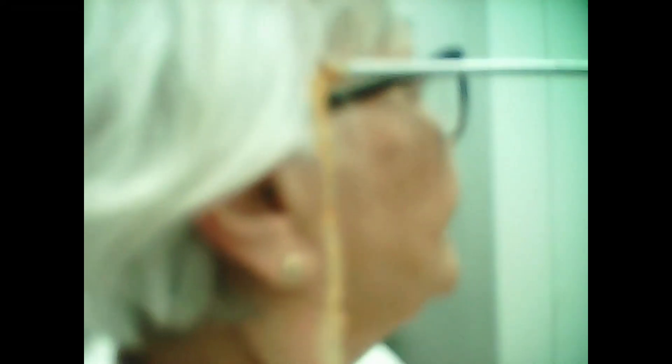Sometimes, as you can see with this client, we get earwax or dry skin buildup that can compound on itself and build up in layers. You can see we've got a really long skin ribbon coming out of that ear — it just keeps going. It's a very long one, some good length on there. Still going — I think the end is near. There we go, so we got about eight centimeters of length on that dead skin ribbon.